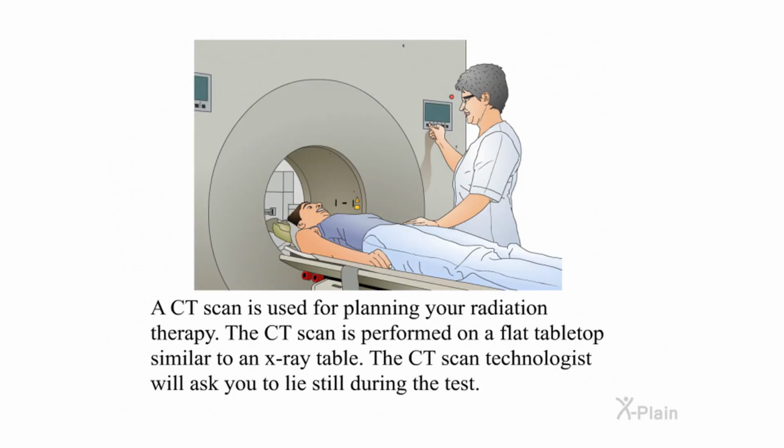A CT scan is used for planning your radiation therapy. The CT scan is performed on a flat tabletop, similar to an X-ray table. The CT scan technologist will ask you to lie still during the test.